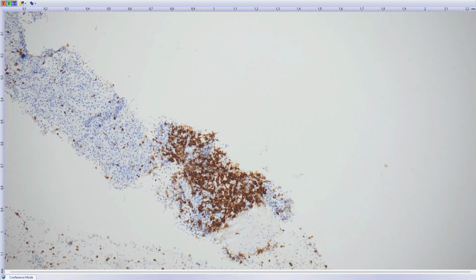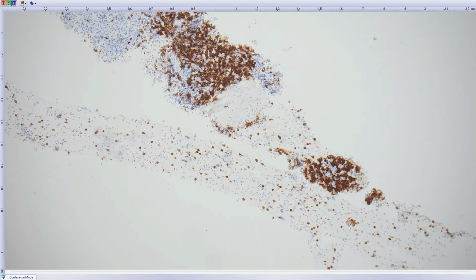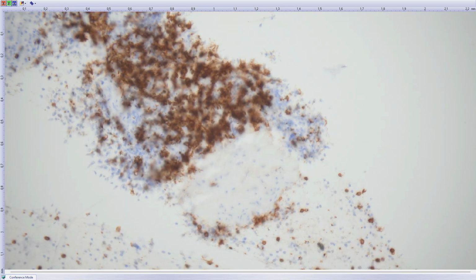Okay. So I had probably 5 or 6 cases last year, and in consultation people don't think about that when looking at biopsies from the pancreas. So diagnosis? Accessory spleen. Maybe that's it from my side.